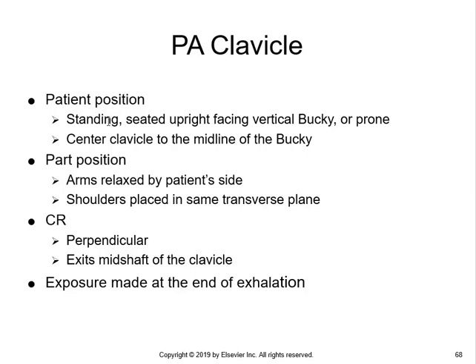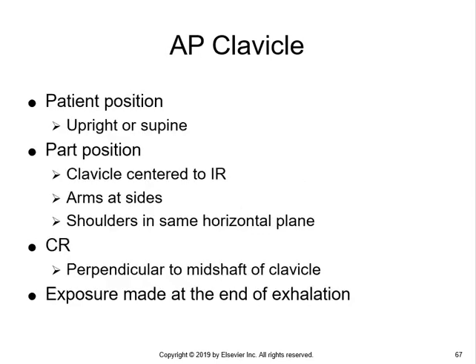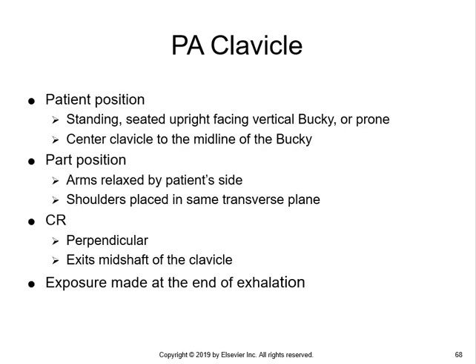Most of the time, if you get the patient on the table, you're going to shoot AP. I've never seen anybody shoot a PA clavicle with the patient prone on the table. So if the patient's upright and you feel like shooting a PA clavicle, you can shoot the PA clavicle. It's going to be an either or situation between the AP clavicle or the PA clavicle.